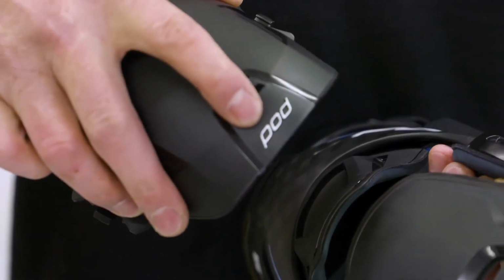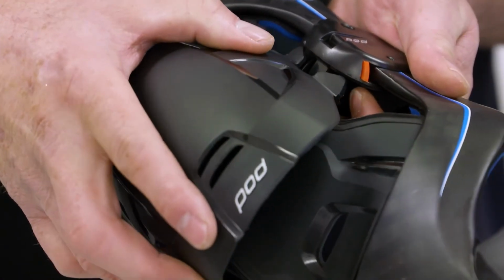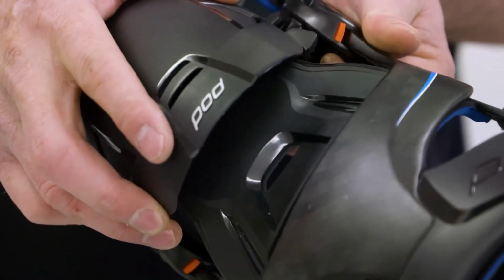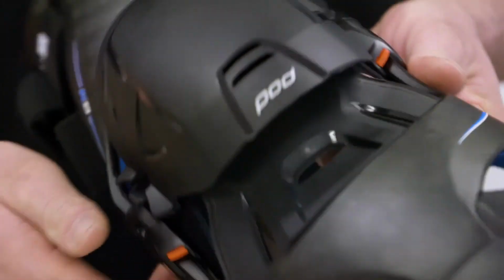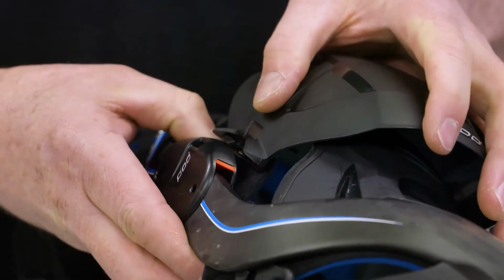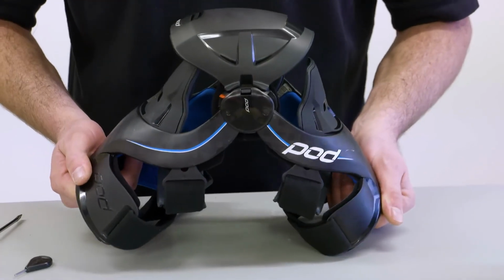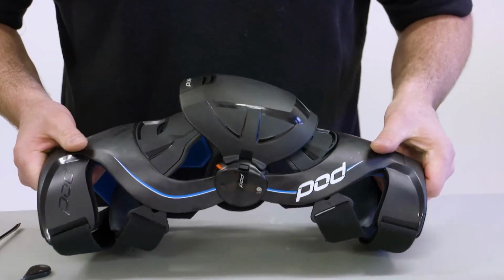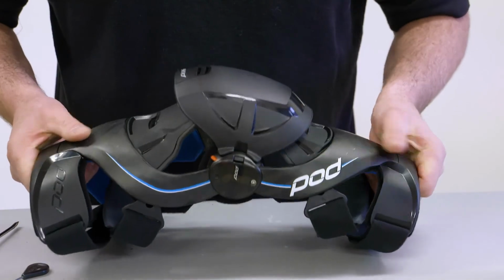Now we'll reattach the patella cup. That can only be attached one way. It's asymmetrical, so you won't be able to put it in upside down. And that will easily snap in, make sure it pushes through and clicks so that the tab's in place on the left and the right side. Again, check that the brace is functioning correctly and the patella is seated correctly by simply bending the brace.